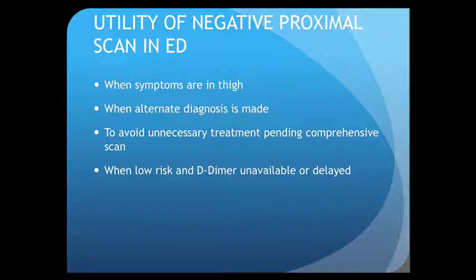We can also, I think, use that to avoid calling people back in, or to have patients hanging around in the department for hours waiting for a formal scan. If you can do this and say, look, there's no proximal clot, let's book them in to a time tomorrow which is more convenient for everybody. I think that's a very useful role for the test.